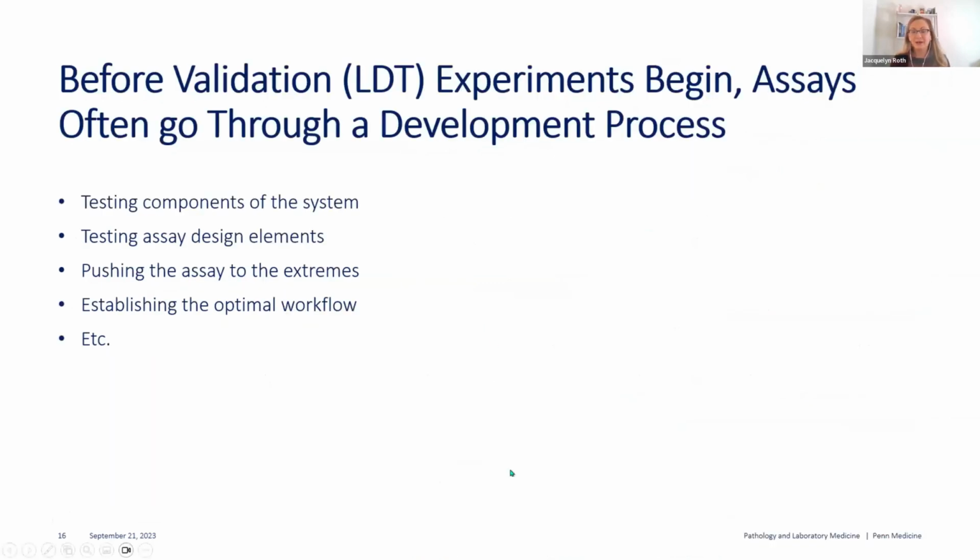So I've talked a lot about validation and verification and what you do when you are ready to bring your assay in clinically. But it's not really that simple, especially when you're talking about a laboratory developed test. Again, different from the FDA. Before the LDT validation experiments begin, we often spend months or even years, or days if you're talking COVID-19, doing different development work and testing components of our system.